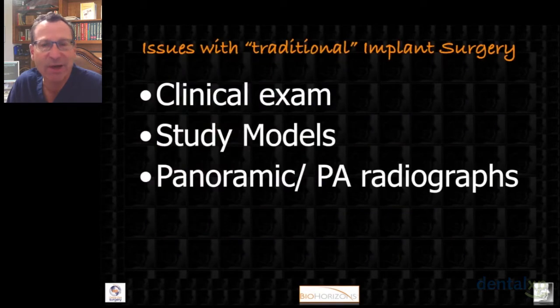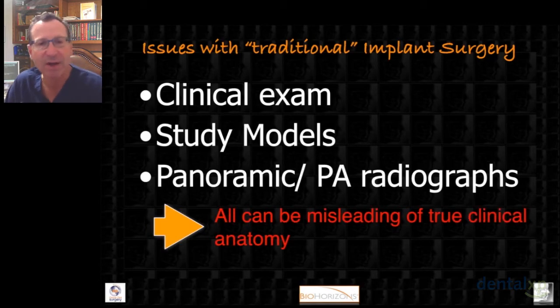It's just that I've learned over the years that there are some issues with the way that we traditionally have done implant surgery. And that is that I've learned that clinical exam and then using study models and panoramic radiographs and periapicals can all be misleading of the patient's true clinical anatomy.